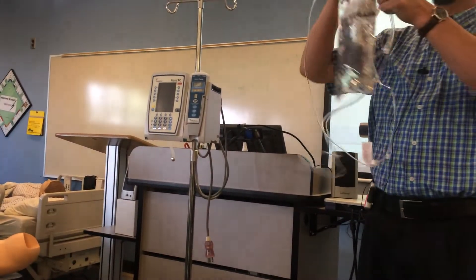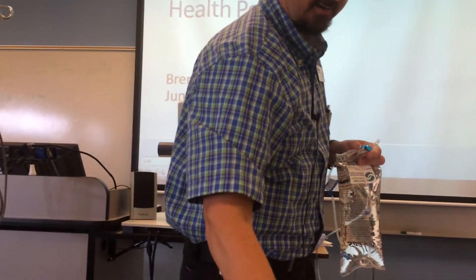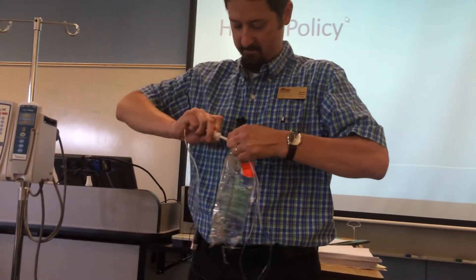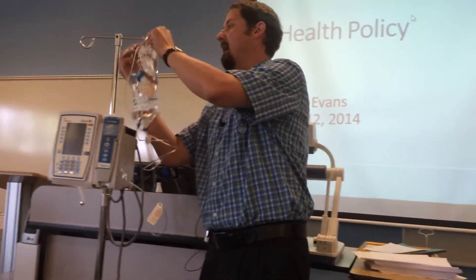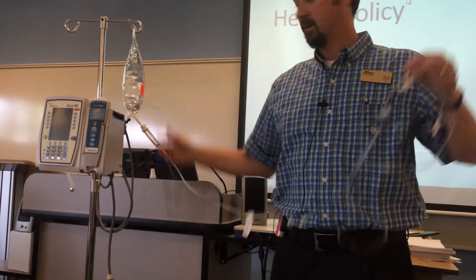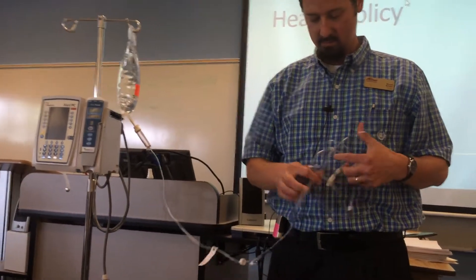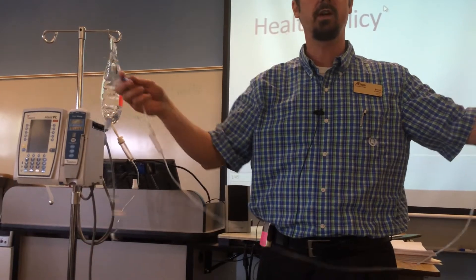Now I'm going to spike my bag. I take the cap off and the spike off, being careful not to touch it, and then I spike the bag. As soon as I spike the bag, I hang it up and get it out of my hands. My bag is spiked — I don't have to worry about it running because I closed off my clamp — and I immediately hang it up on my IV pole.